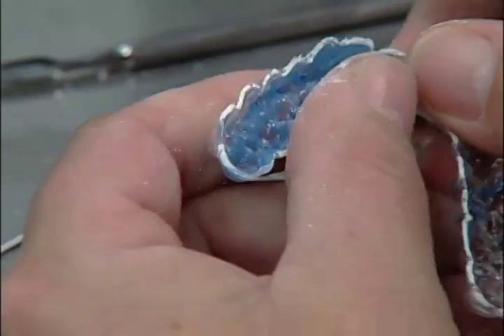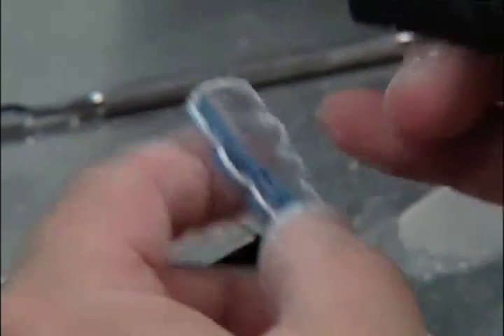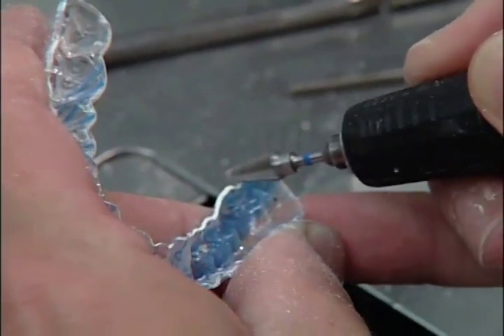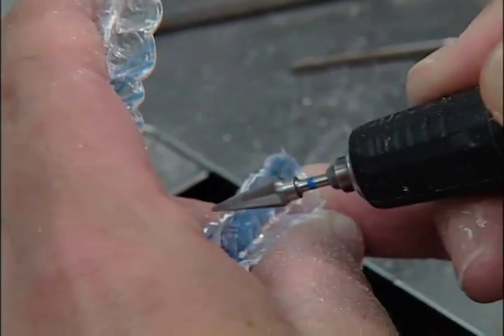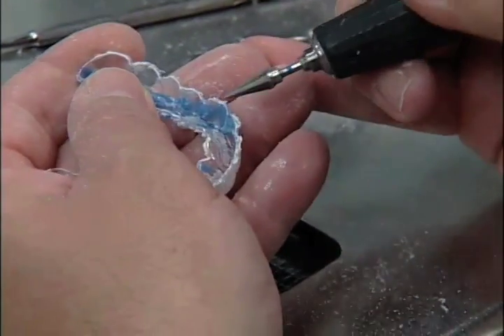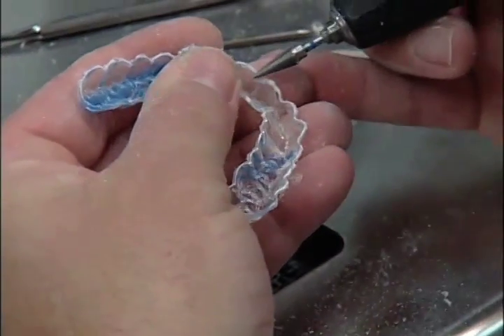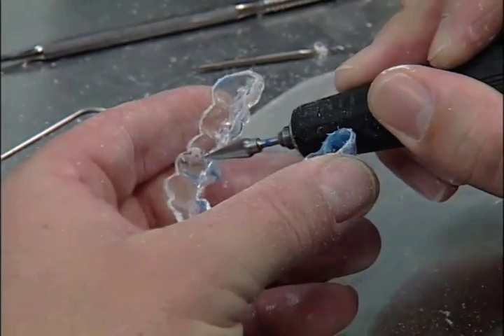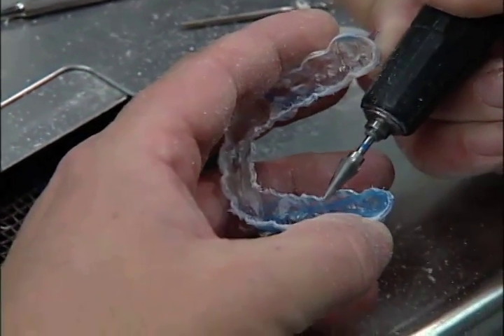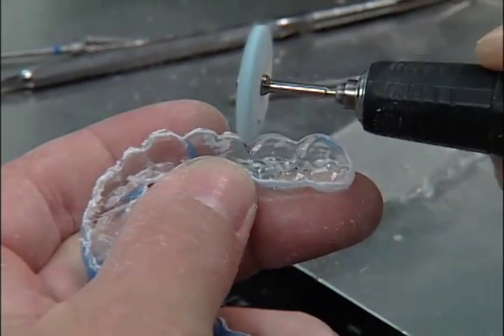Using the cross-cut carbide, taper the entire outside edge and inside edge of the retainer. Next, using the Lisko S disc, smoothen all edges.